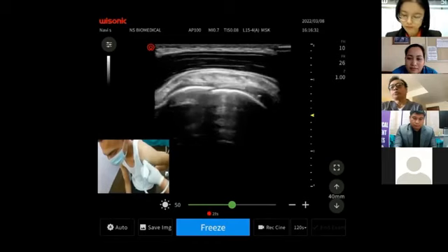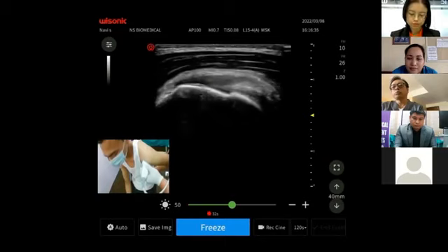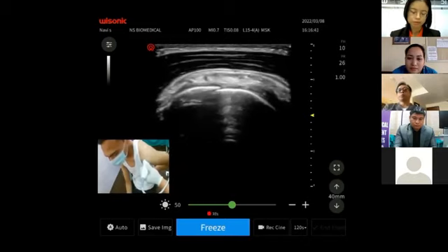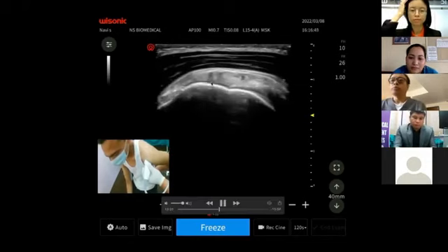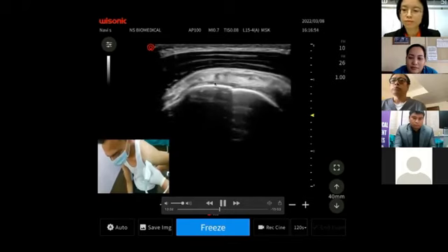As long as we see this normal fibrillar pattern, this is a normal tendon. This anisotropy could be because of the curving of the fibers of the supraspinatus tendon. Still, when we look at the insertion of the tendon to the greater tuberosity, we see some thin hypoechoic line, that is the articular cartilage, above which the fibers of the supraspinatus tendon go and insert to the greater tuberosity.